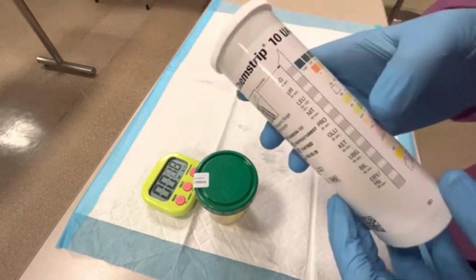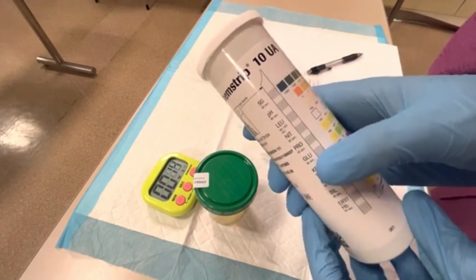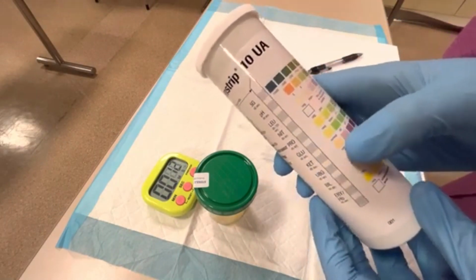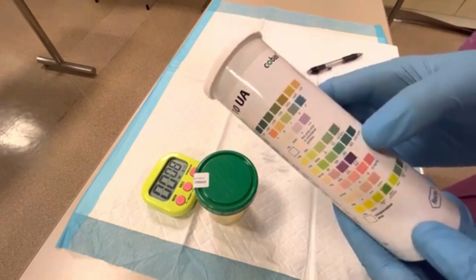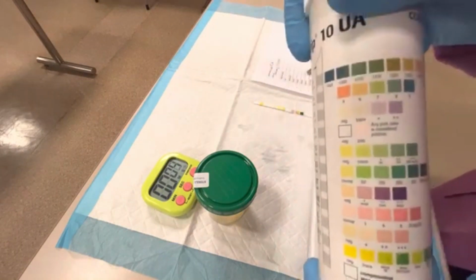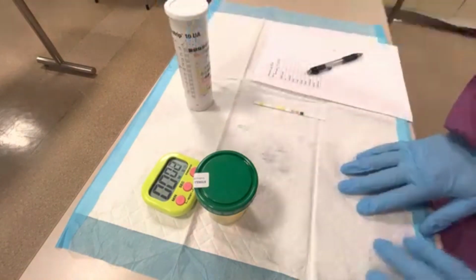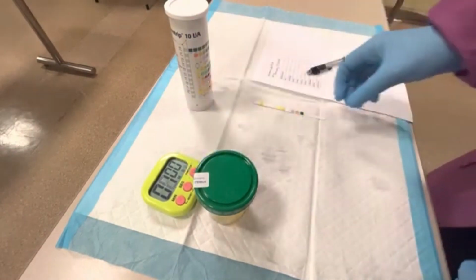So for example, the glucose. Glucose is read at 60 seconds, and it gives you a normal result, 50, 100, 250, 500, 1,000 milligrams per deciliter. It's semi-quantitative. It's not an exact amount, but it's a good range. So that's what we mean by semi-quantitative. Okay, our timer is going off. Let's take a look at these.